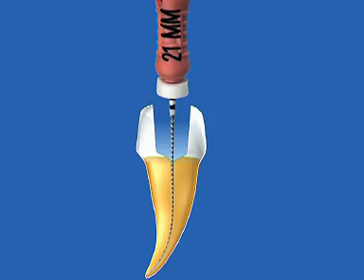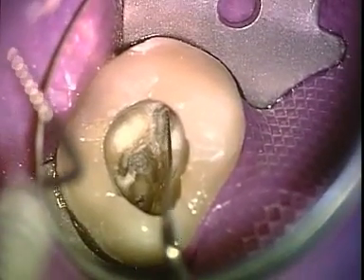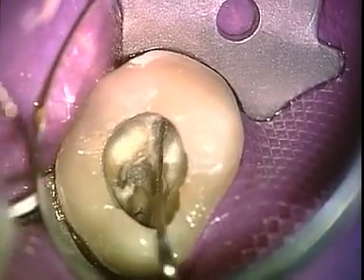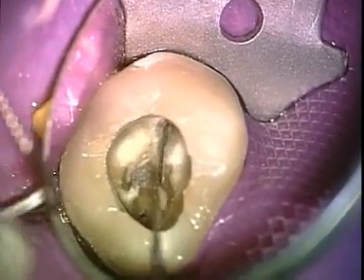The first step is to check the patency of the canals. C-pilot files, ISO 06 to 15, are ideal for this. Or, in the molar region as here, MC files with a long handle. If necessary, the openings can be exposed with a round burr.